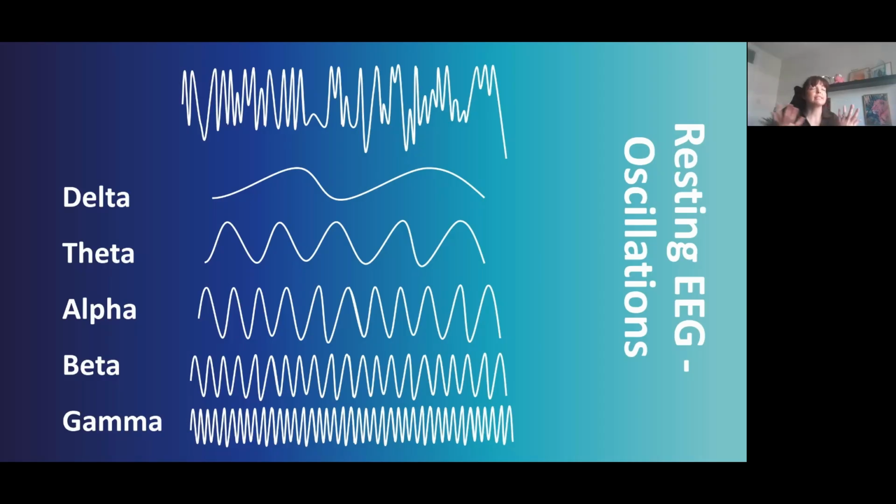These different oscillations in different brain areas are associated with different cortical functions. That allows us to get this really rich information from across the scalp and to look at how your drug is modulating an array of different brain activity, all from this single signal.